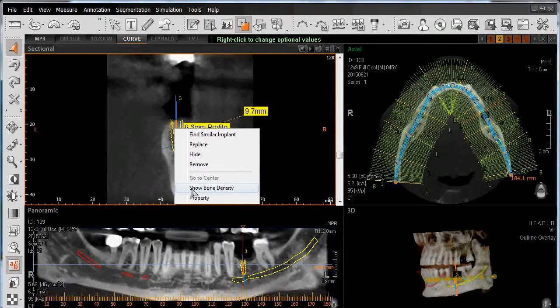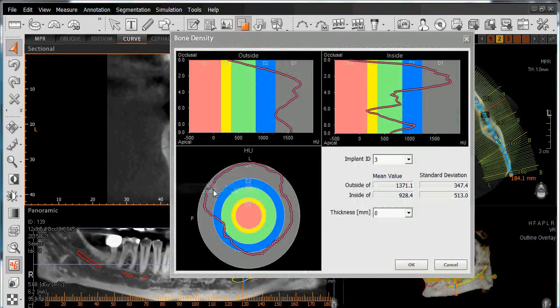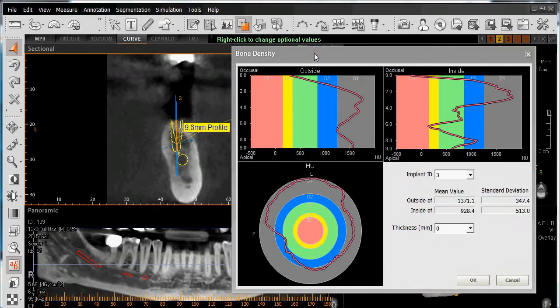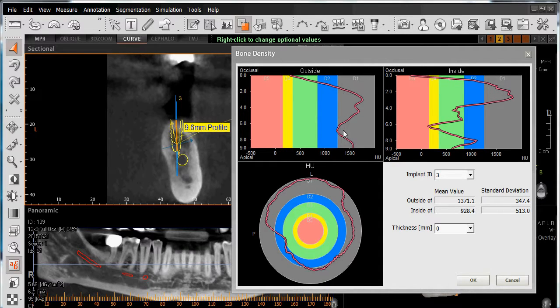I can also come down here to Show Bone Density. Left-clicking on Show Bone Density will allow us to assess the bone quality where we're placing our implant. The Bone Density chart will help us verify that the supporting structure is able to hold the threads of our implant. We can look around the outside of our implant from the occlusal end to our apical, and see where it falls on our density chart. D1 bone is consistent with cortical bone, D2 and D3 with trabecular bone, D4 getting to low quality bone down towards fluid, and D5 being basically air.